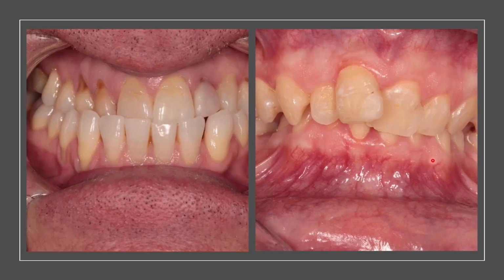Couple of cases here. Actually, the case on the left we did actually treat, but that's the subject of a separate webinar. Ordinarily, that would be a red case, and the case on the right, severe crowding. Again, this is not to be prescriptive about this, but this is certainly not a simple case. This is an extremely complex case, and so certainly not one which would fit well with a general practice workflow.